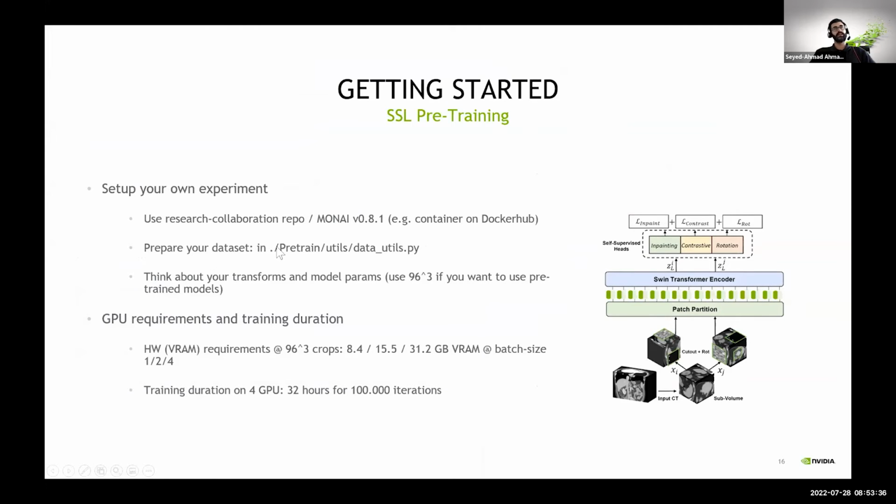Prepare your data set in the subfolder of pre-train. In utilities, there's a file called data util. So you just have to exchange the data and create your own data list if you want to use your own data.